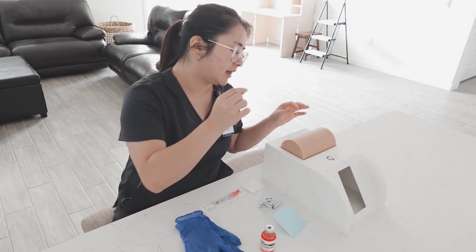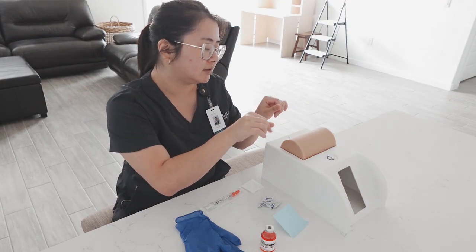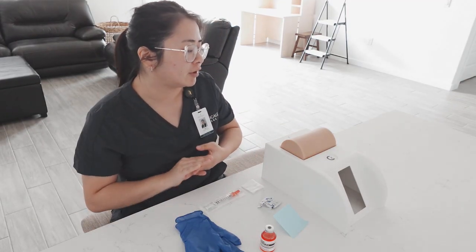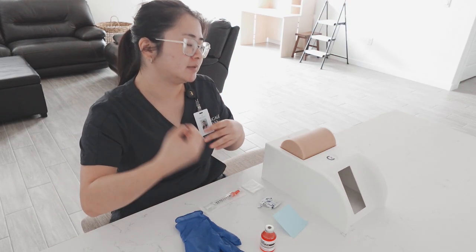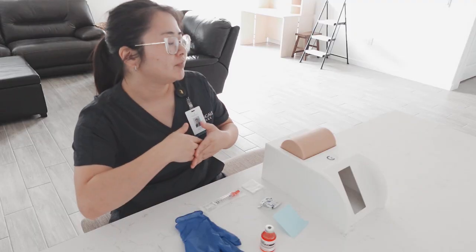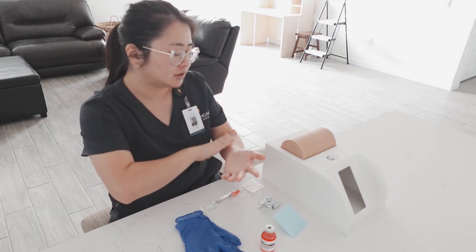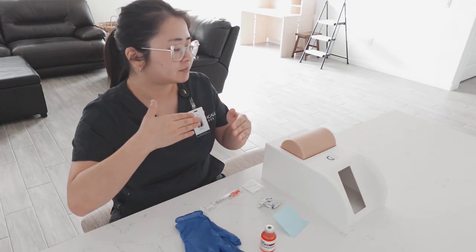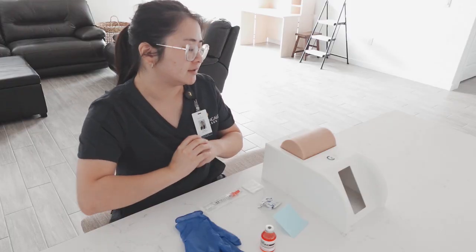So what's going to happen, I'm going to inject slightly underneath your skin. You might even see like a little bump form on your forearm. And that's supposed to help us indicate if you've been exposed to tuberculosis. You're going to come back in 72 hours, and from your reaction based on that injection, we will determine if you've been exposed to tuberculosis.